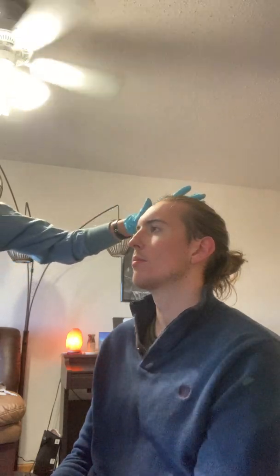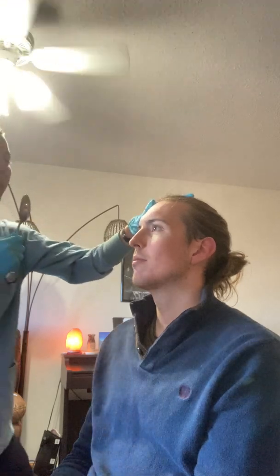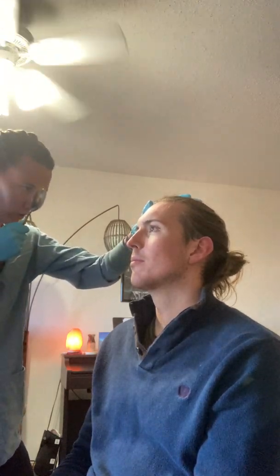So I'm gonna have one more test here with my ophthalmoscope. I'm going to check behind your lens and do my fundoscopic exam. Okay. So I'm gonna place one hand on your head here. Does that feel okay? And I am holding my scope in my right hand, looking at your right eye, standing at a 15 degree angle.